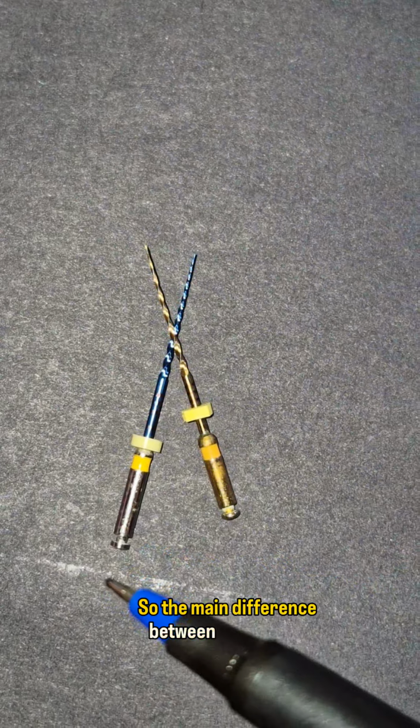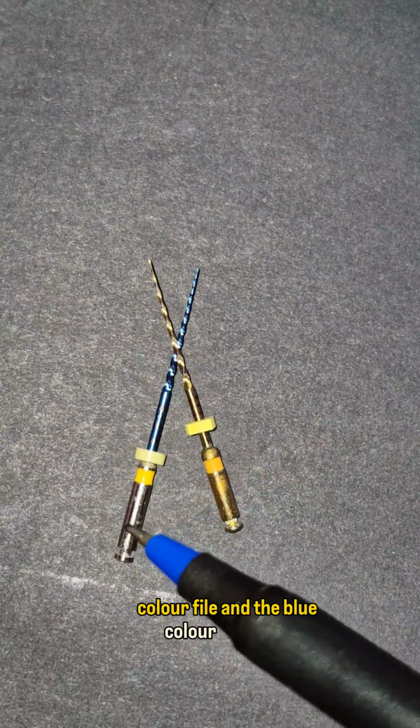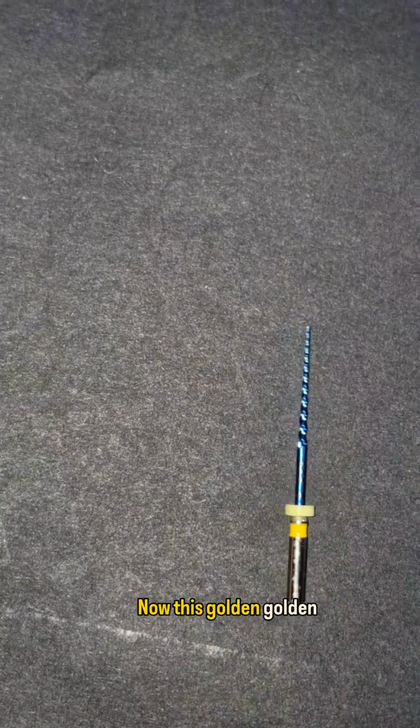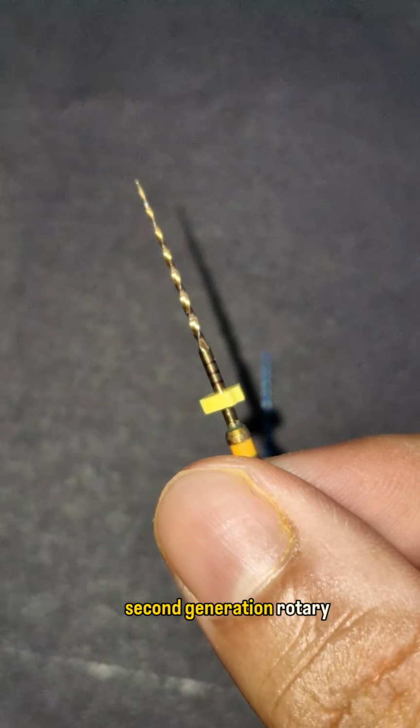Now coming to the generations of the ProTaper files, we have a total of 5 generations of ProTaper files. First generation, second generation, third generation, fourth generation and fifth generation. So the main difference between this golden color file and the blue color file is the generation gap between them. Now this golden color file is from the second generation rotary system.